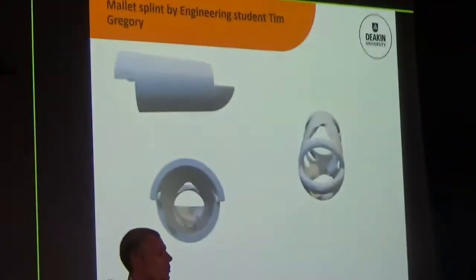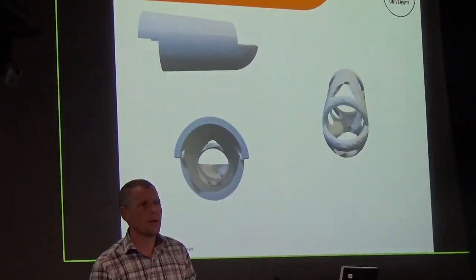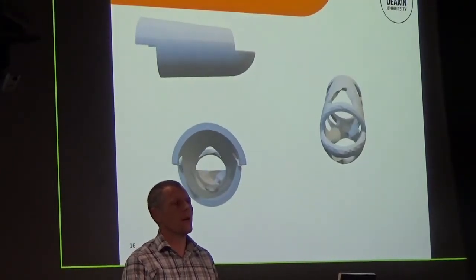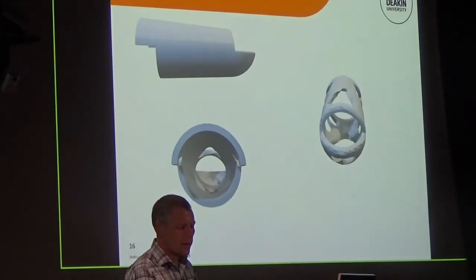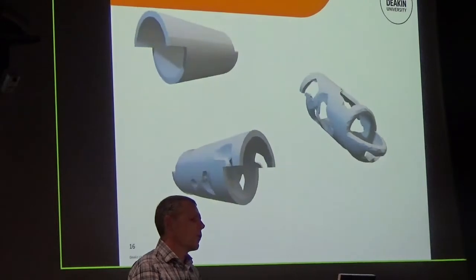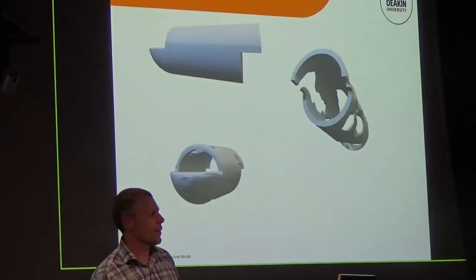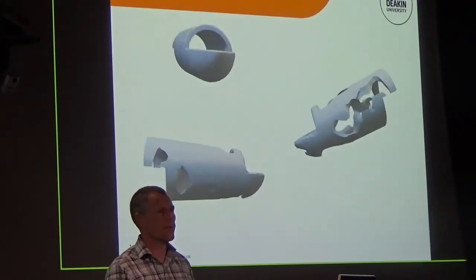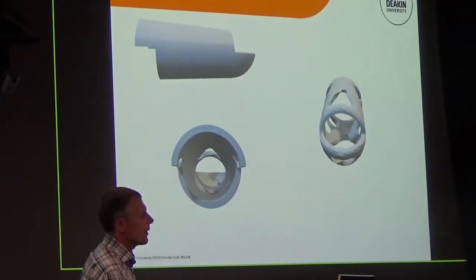So there's an engineering student, Tim Gregory, who's over at Deakin, and he's made these mallet splints. And what I mean by designing and testing, he basically copied the top splint, which is a commercially available mallet splint. How good they are is questionable, but anyway, he's made that, and he's used some programming to test the strength of it. So now he's gone through and reduced the material, and the one sitting by itself with all the big holes in it has the exact same amount of strength through testing as a full splint, in the sense of essential points of strength. So they've tested to see where it requires power and strength within that splint, and therefore can remove material.